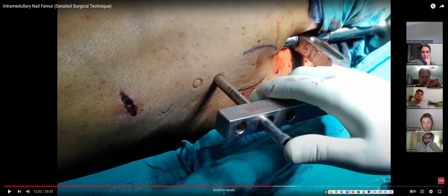We cannot change the position of the patient because we have no control of the distal leg because it is fractured. It must be aligned with the body. So this problem has always been present with the femoral nail, and somebody has to change it. Okay, I wanted to show you one of the problems we have with these devices.